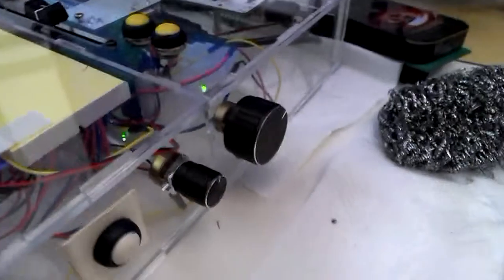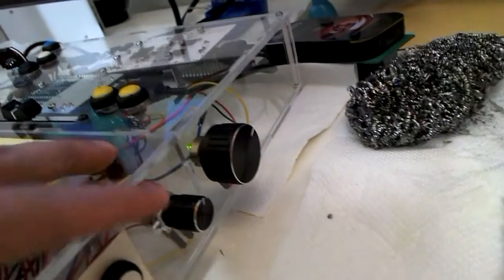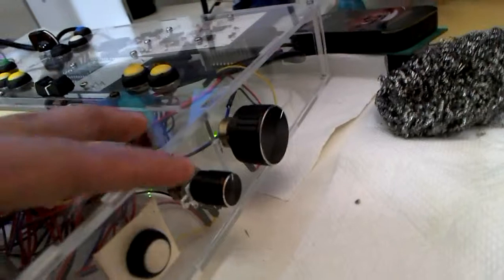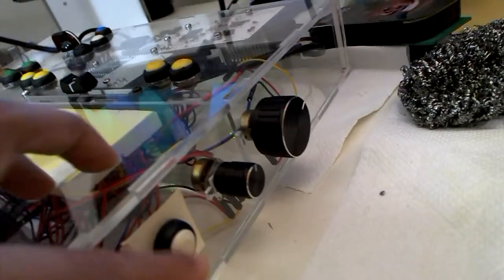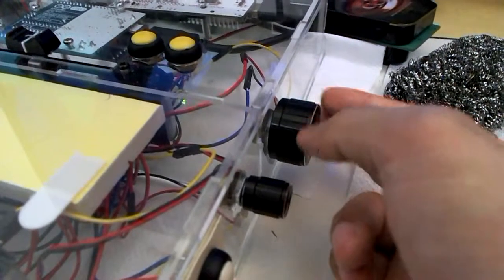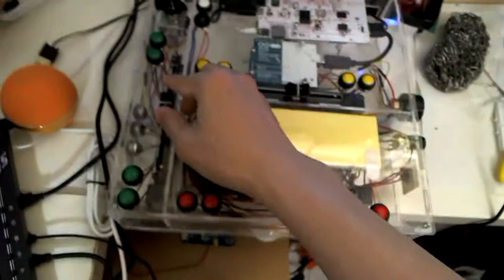The large dial is for me to adjust the speech rate, the general speech rate, and the small one is for adjusting the spelling rate, and this one is for switching between languages. So let's try to increase the general speech rate. Okay, now that's super fast. Yeah, that'd be fun.